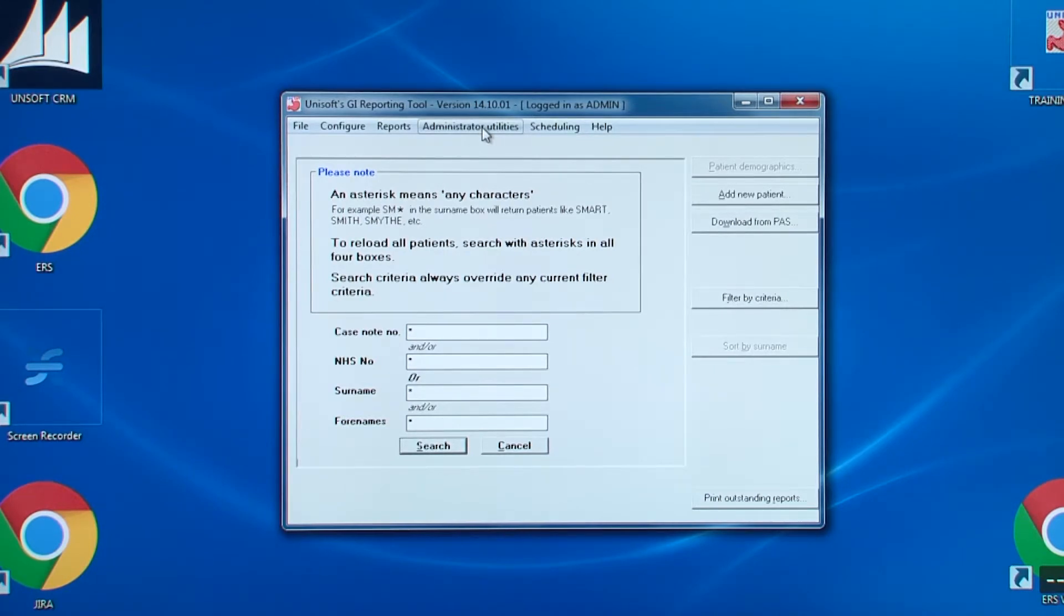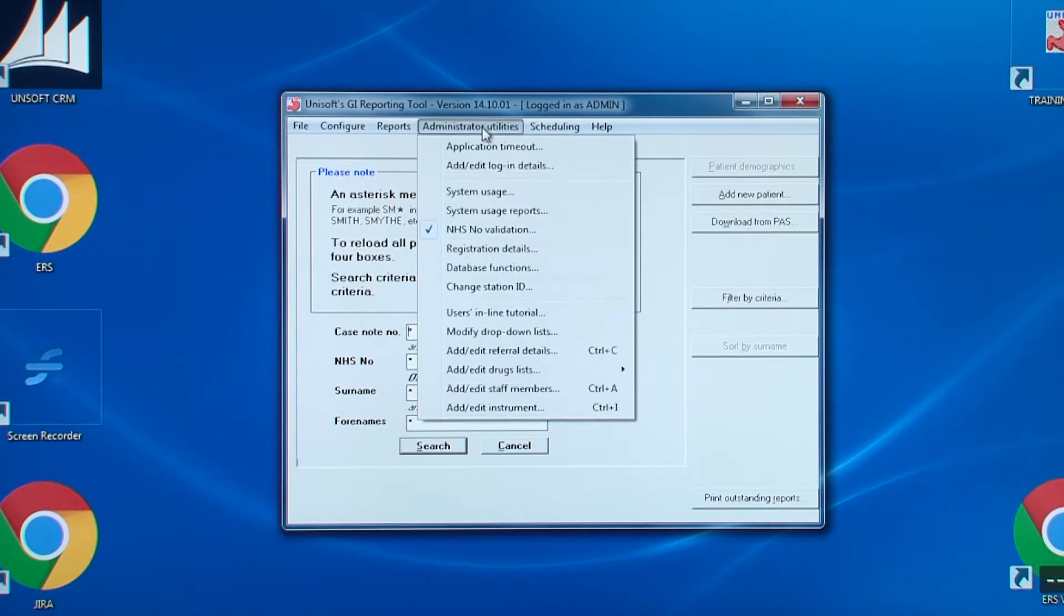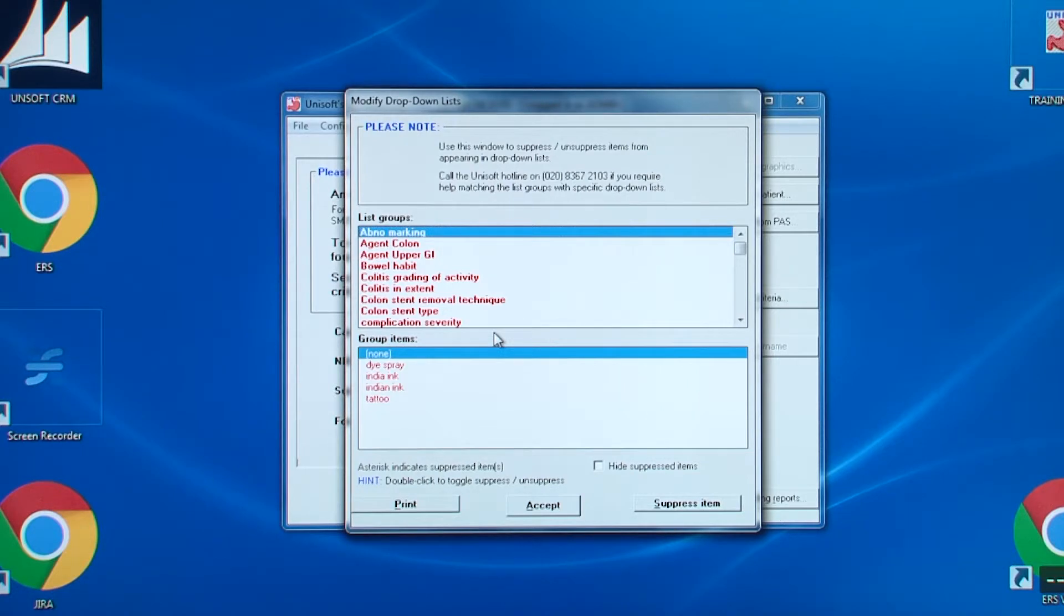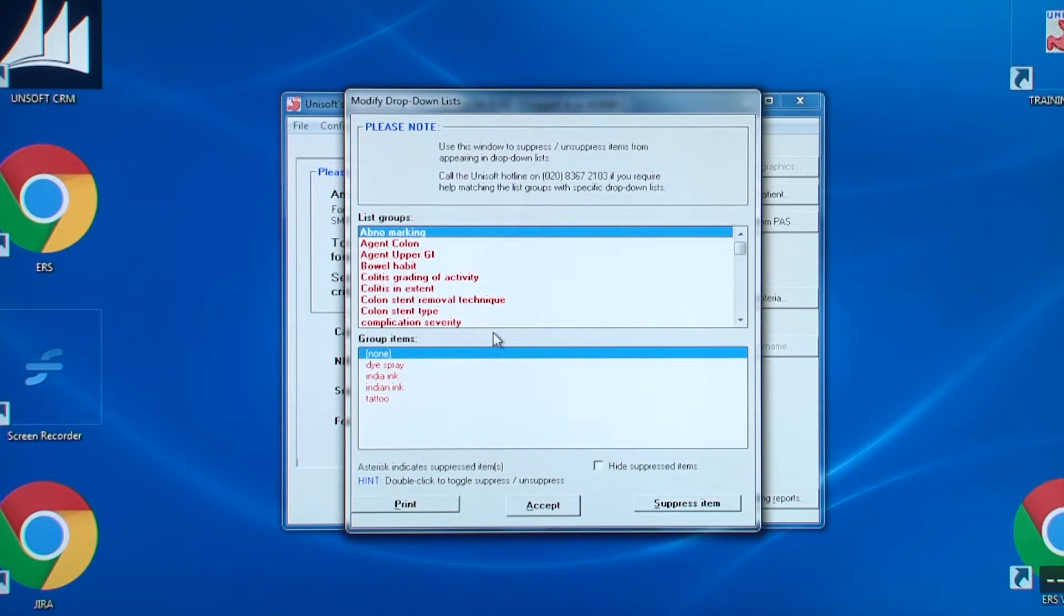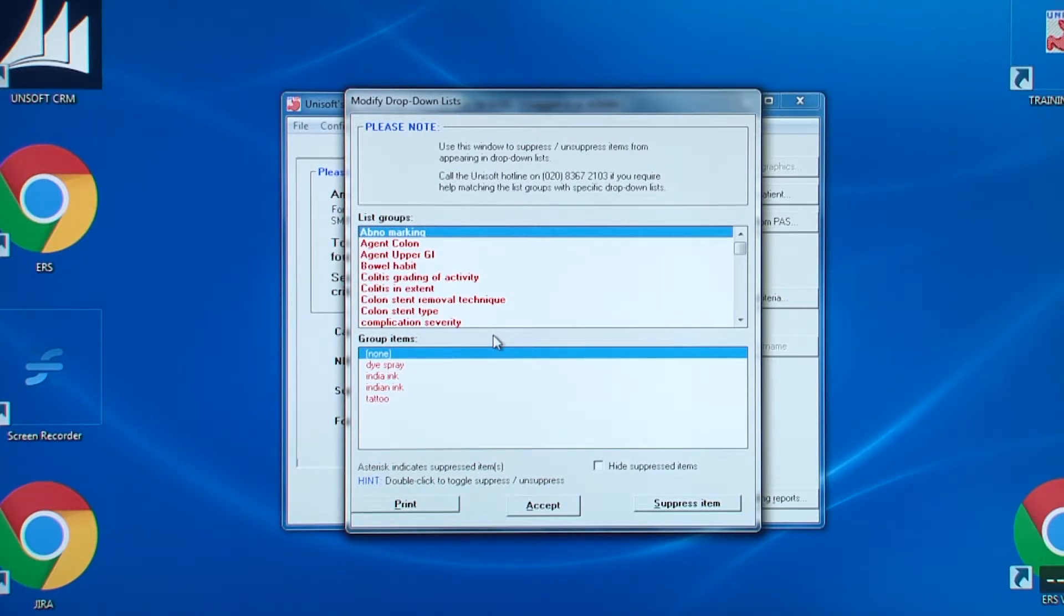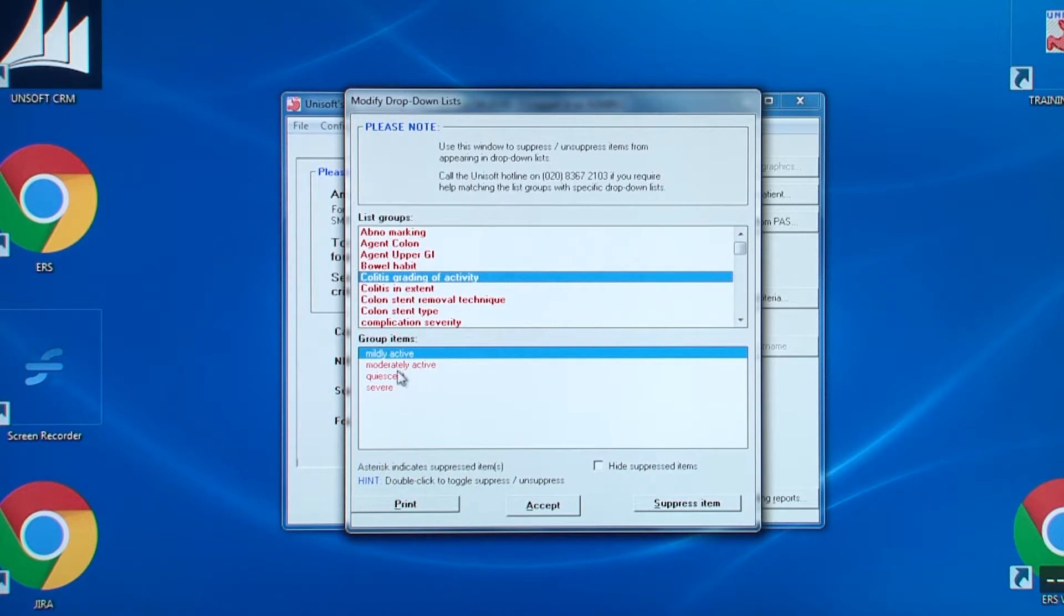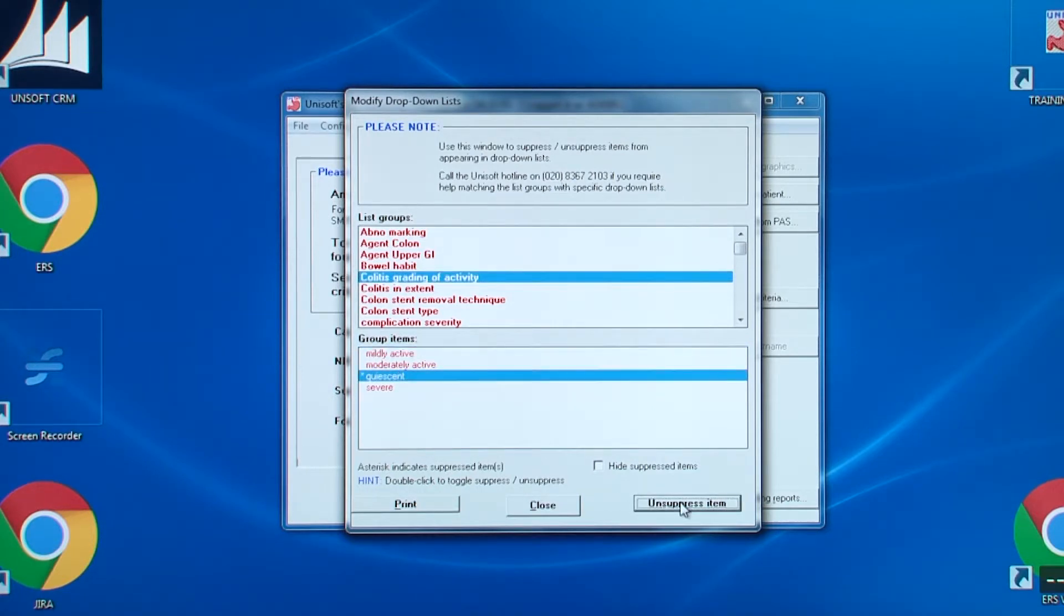The next is modifying drop-down lists. You cannot add items to the lists in this screen. This must be done within the actual drop-downs to make sure that you've added entries to the right list. What you can do here, though, is suppress items from appearing in the drop-down lists for all new reports. If you go back to previous reports, you will still see all entries in the drop-down boxes. In the top half of the screen, you choose the prompt that appears beside the drop-down box and the entries appear in the lower half. You can suppress and unsuppress entries by double-clicking on them.